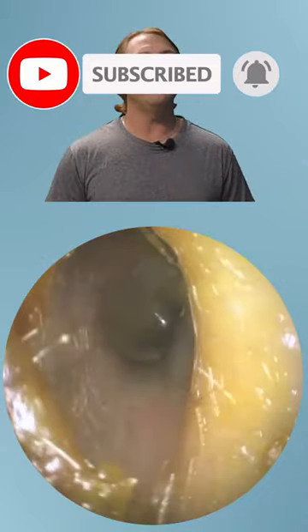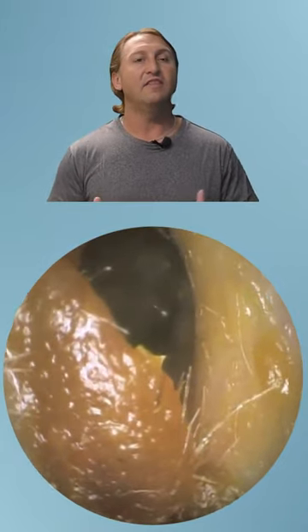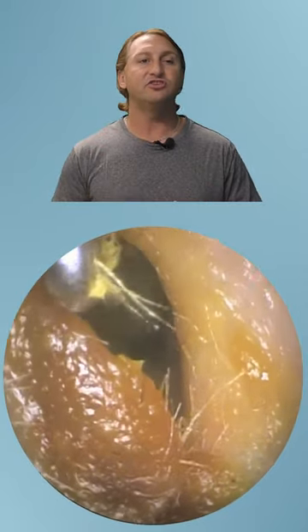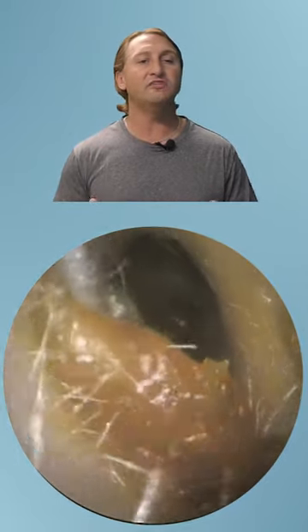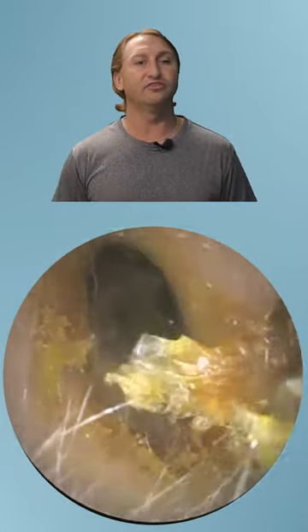We're going to jump over to the other ear here. On this side, it's not nearly as bad. The patient was only having fullness on one side, but again, if they're coming in for a wax removal, we're going to do both sides.